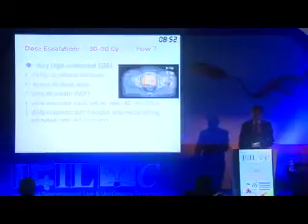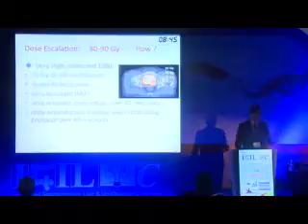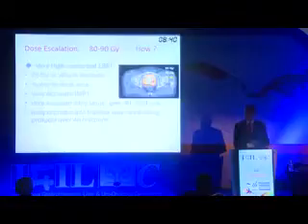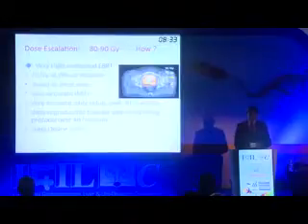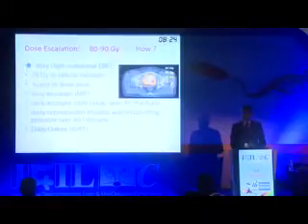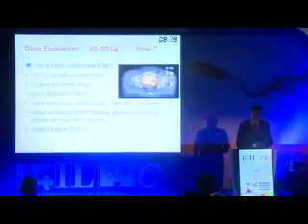filling protocol. The bladder and rectum should be in the same position every day, because they may lead to a forward and backward movement of the prostate. So 1 millimeter matters, and this will violate the dose escalation. This is the one method of how to increase the dose escalation. Also we have to combine this with the daily online IGRT. It's very important. This is not feasible. It's not ready in every center to apply online imaging every day.